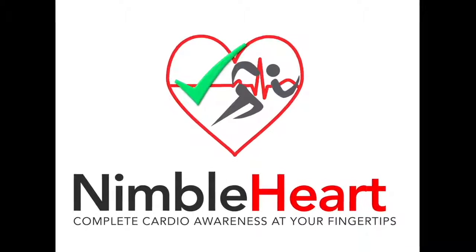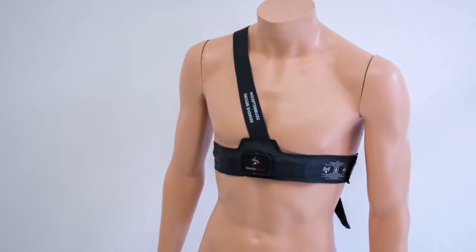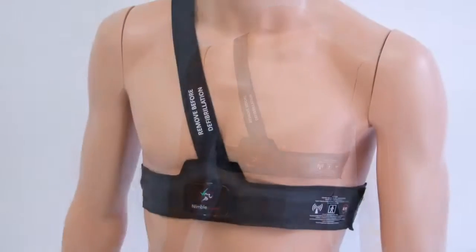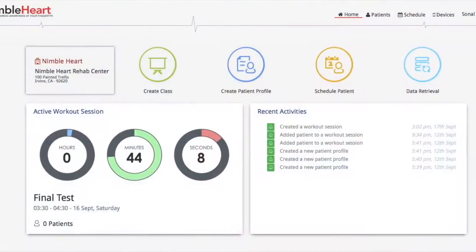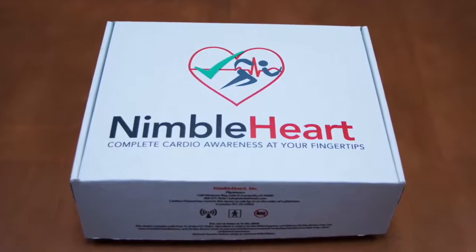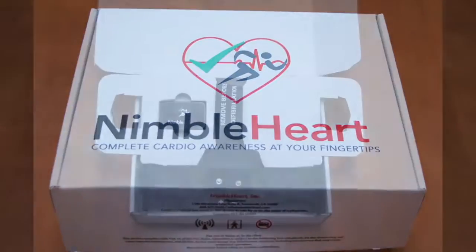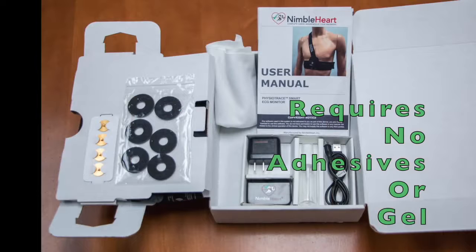Physiotrace Smart is a wearable and reusable ECG harness with dry electrodes. It continuously acquires ECG data and transfers it to a monitoring device for review and storage. The Physiotrace Smart harness has three electrodes and only one shoulder strap. There are two parts to each Physiotrace device: the harness and the mobile software application.